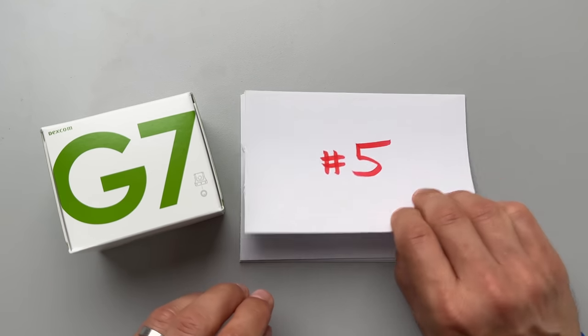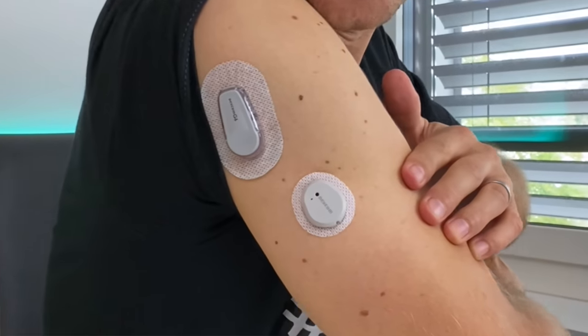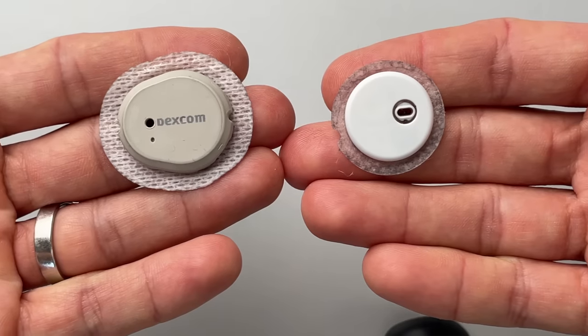Secret number 5 — more of a fun fact: do you know why the G7 is gray? When I talked to the Dexcom product team in San Diego, they told me they had a very specific reason for choosing this exact color and shade. It proved to be the color that best blends with all human skin tones — when you look at the sensor from several meters away, you can barely see it. It makes me curious whether we'll ever see more colors in the CGM space — blue, red, or yellow CGMs. Would you like that?